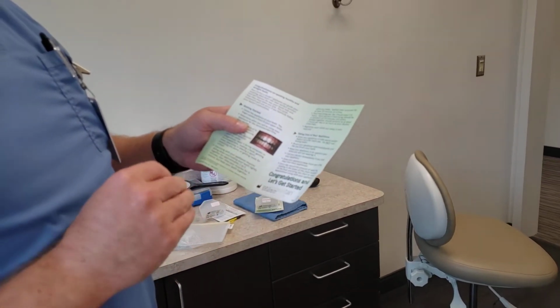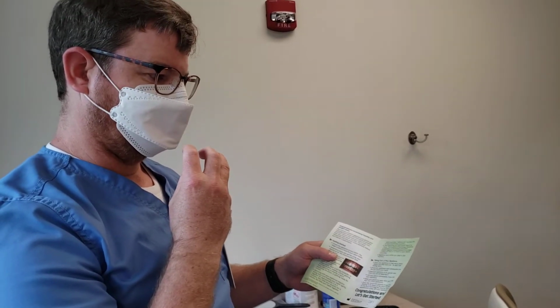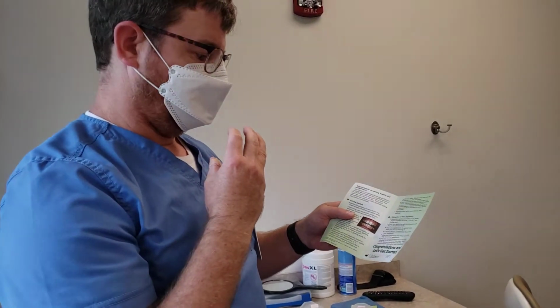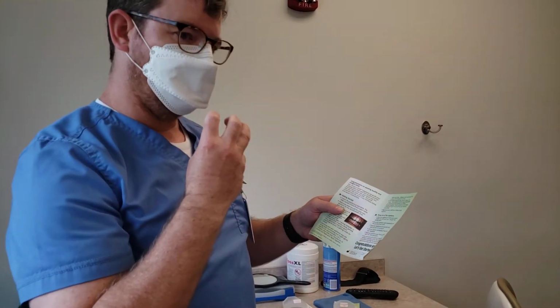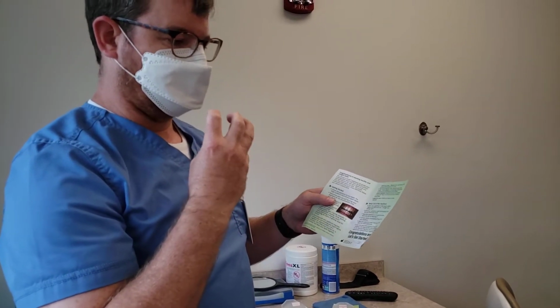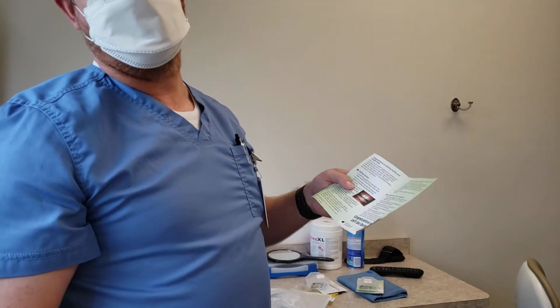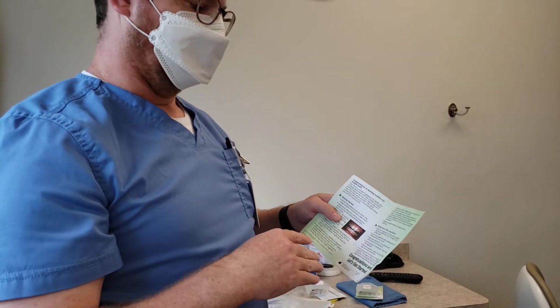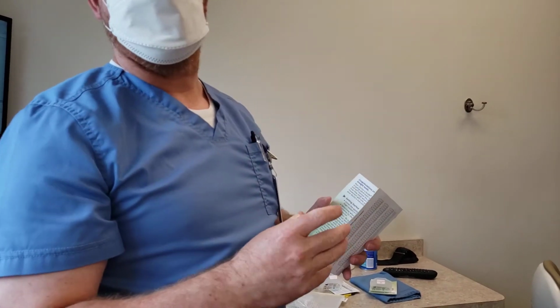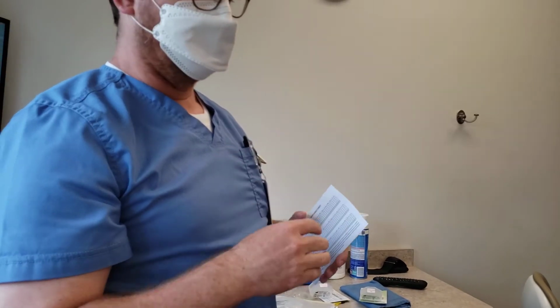When they're exercising, they have the appliance in their mouth and they squeeze for about a minute, and then they relax the pressure, but they keep their teeth in the appliance for about 30 seconds. So it's squeeze, relax, squeeze, relax. You squeeze twice as long as you're relaxing. You want to do it a minimum of 20 minutes each session. Eventually you'll need to be doing this like 2 hours a day. But right now I just want him to get used to it. Since he still has some loose teeth, if he were to squeeze too much, it would make him sore.